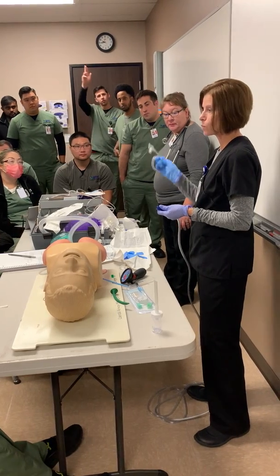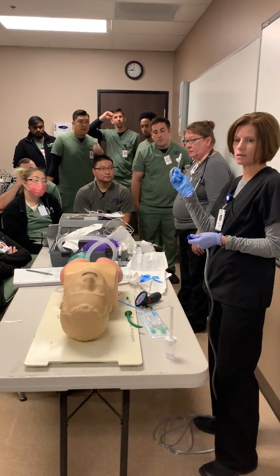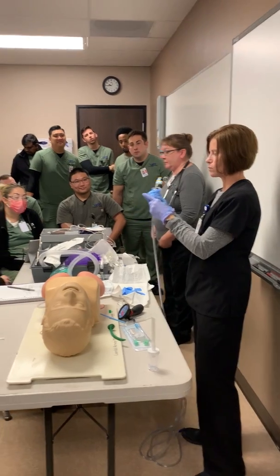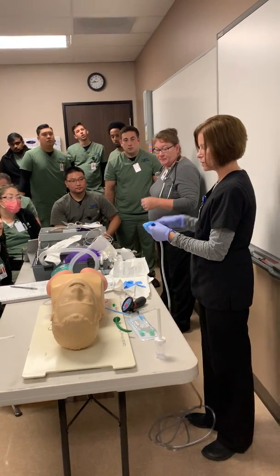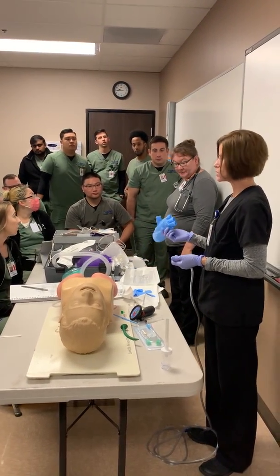Practice is key. One of the trickiest parts is just getting the gloves on and keeping this thing clean. The first couple times you do it, especially if a patient's awake, you're going to be nervous, and you're going to put your thumb in one of the pinky ports. It's notorious. And then when you're done, you just peel it off over the catheter. This goes in the trash. You make sure your patient's doing okay.